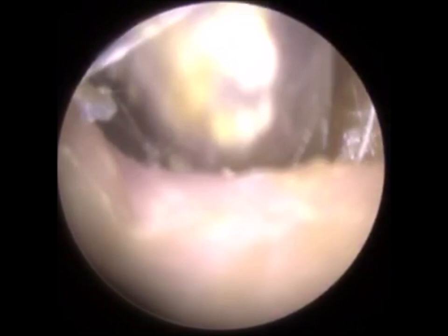But with the endoscope again, we just get such an amazing view of his mastoid cavity. So we can see it, and there's his perforation to the right. Had a little glimpse there. There we are again. You can see that on the right hand side, just in view. And if you're continuing to watch this video, this remaining piece of keratin doesn't look a lot, does it, on camera, but you'd be quite amazed and shocked when I eventually remove it, just how much there was. Because again, this client's got a cave at the base of the mastoid cavity, and it's a large trench, and there was a hell of a lot of keratin there, a huge piece.